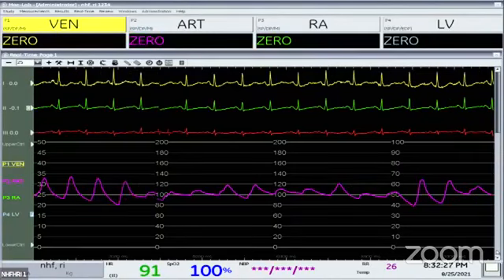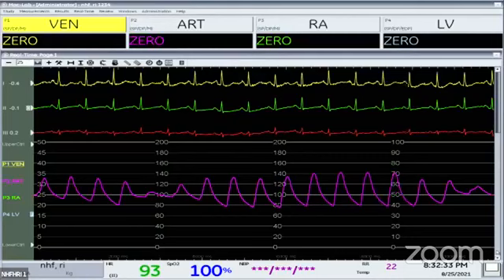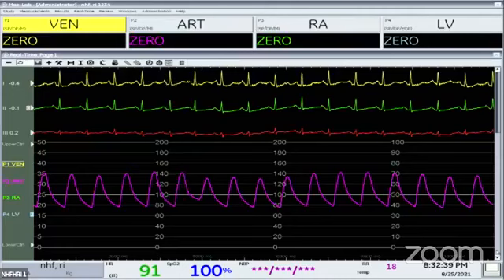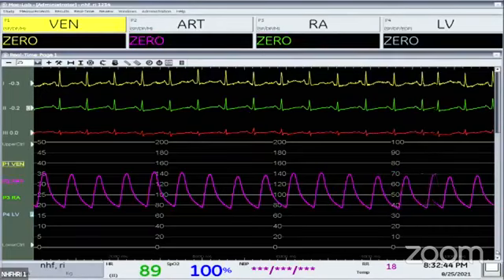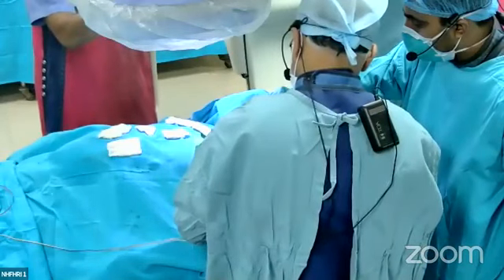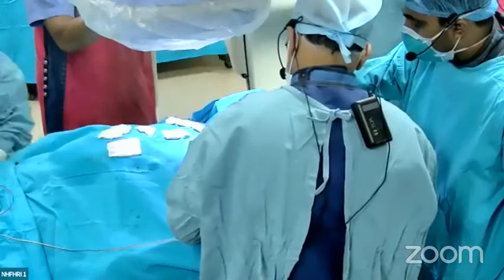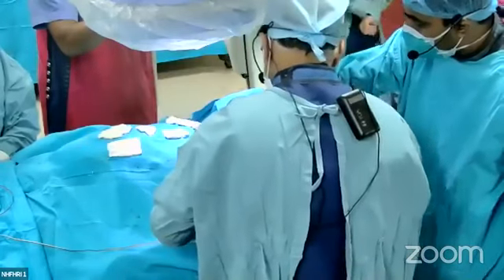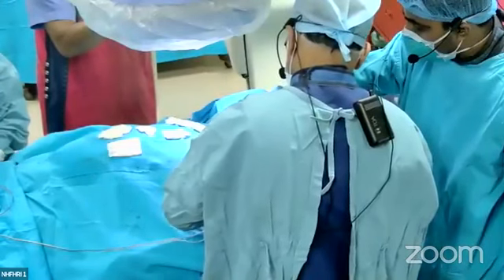So now I am fixing the atrial lead with the underlying muscle. Professor Mohsin, Dr. Habib, any comment regarding right atrial lead fixation and lead position? Very good. What complications may happen in atrial lead implantation? Sometimes the atrial lead may dislodge, very frequently, especially tine leads. Screw leads are more stable, it depends.